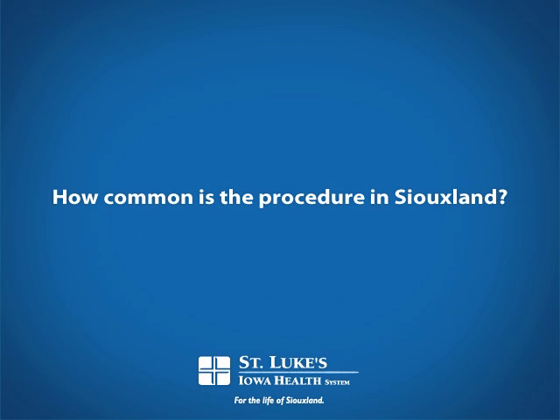How common is the procedure here in Siouxland? Well, cardiac catheterizations are done quite commonly. And if you look on a national basis, right now about 5% of cardiac catheterization procedures are done radially.